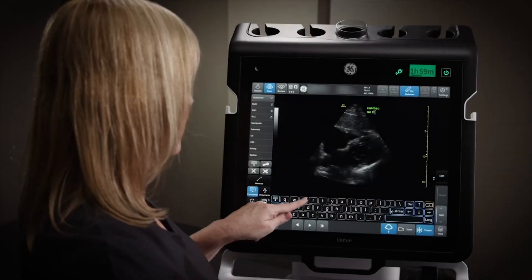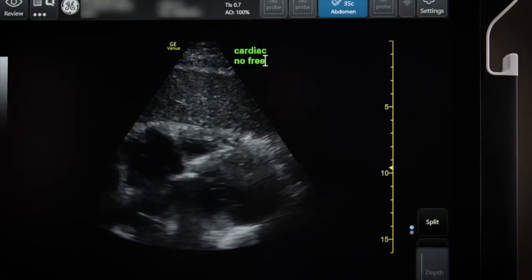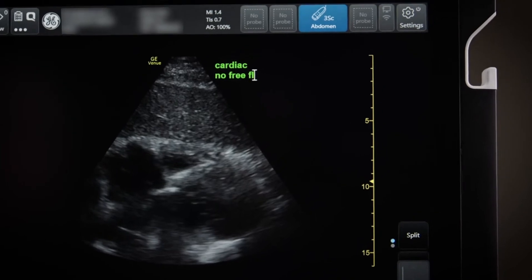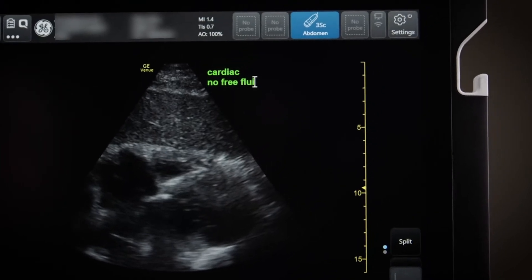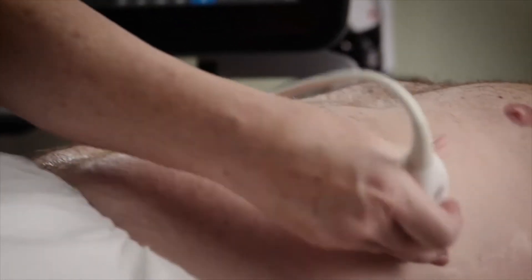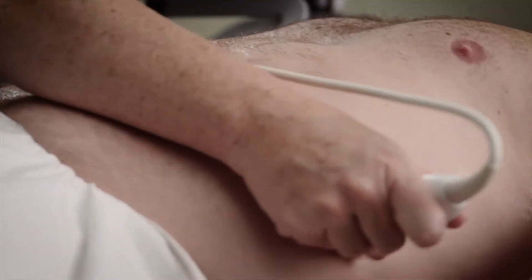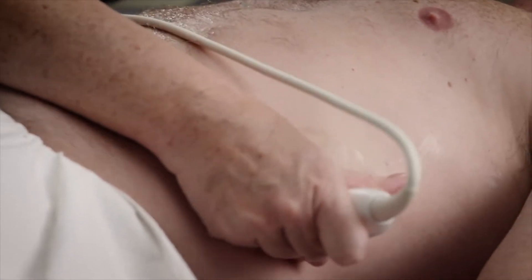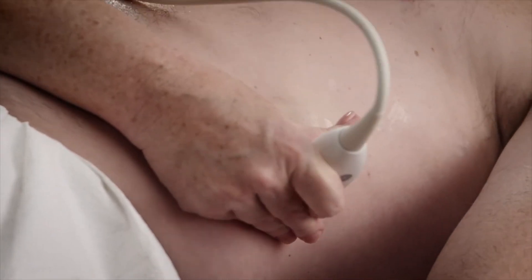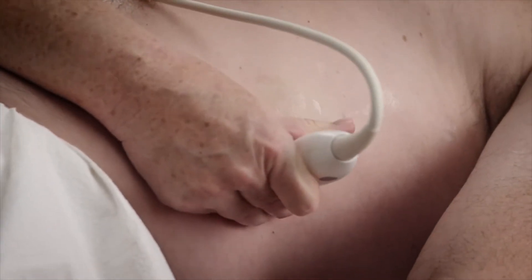During traditional eFAST exams, labels and findings have to be manually entered for each of the scanning zones. It counts on you to remember to scan every zone and then review each of the images to make sure your report is complete.